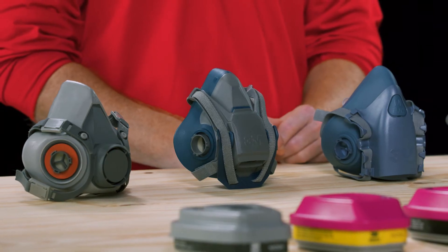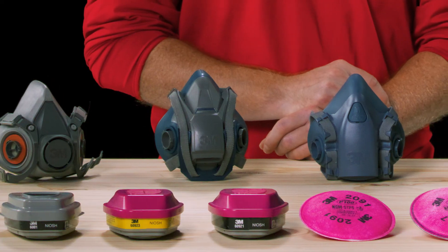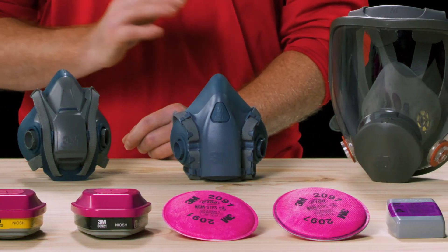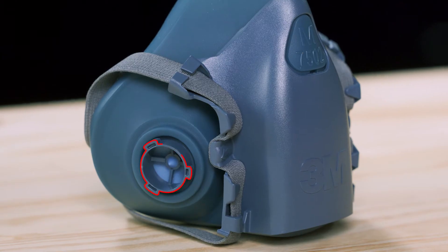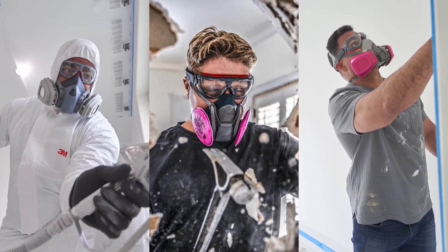3M has a variety of respirator face pieces with a 3M bayonet connection system that allows you to select from the compatible assortment of cartridges or filters for a variety of hazards. For example, this 3M 7500 series respirator with a 3M bayonet connection can be used with all of these different cartridges and filters that work for a wide range of applications.